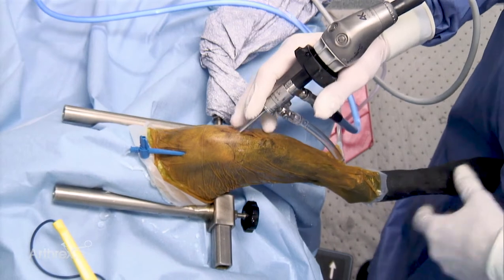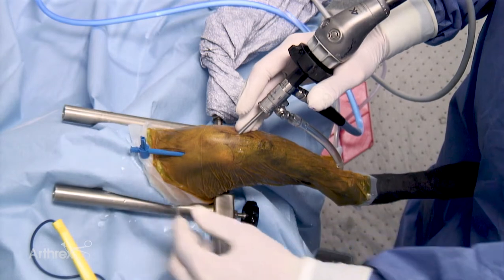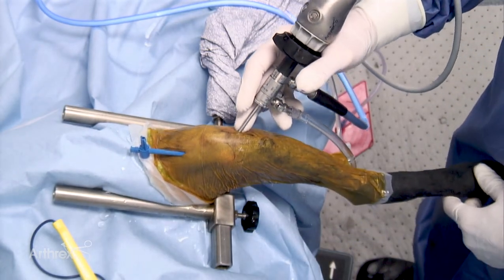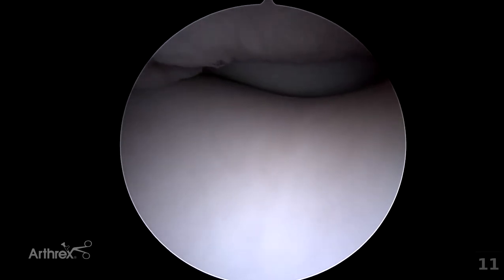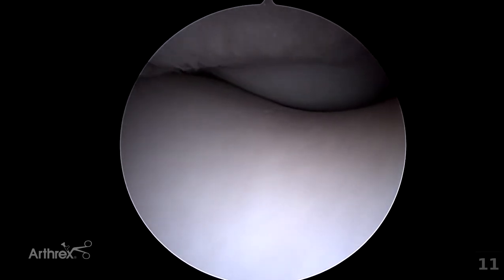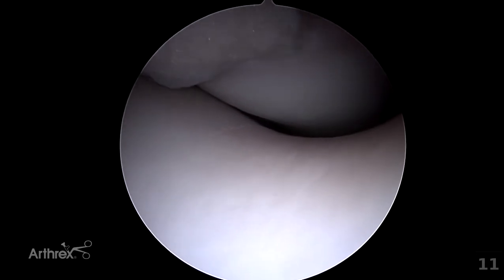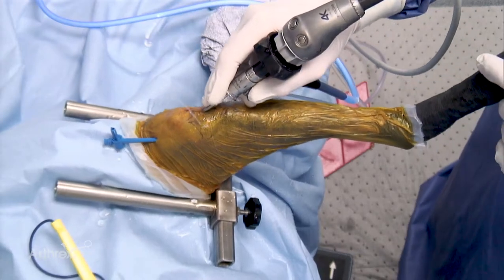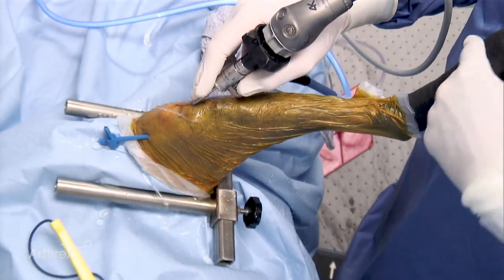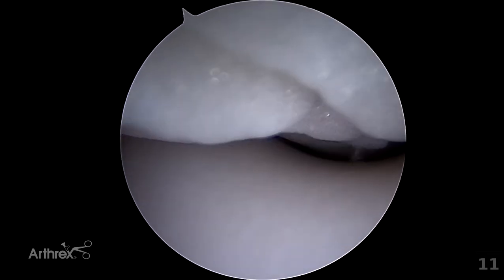At this step we examine the joint to see if we are inside the joint and we can evaluate or establish vision of the cartilage layer. By use of the light post looking upwards, adjustment of fluid flow, and distension of the joint can be maintained. In this position we are looking dorsally at the early portion of the trochlear groove. The patella is visualised sitting within the trochlear groove. By extending the leg at the hip, one is able to maximise visualisation in this area.